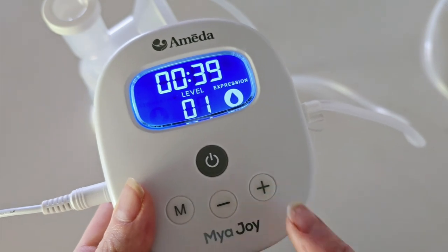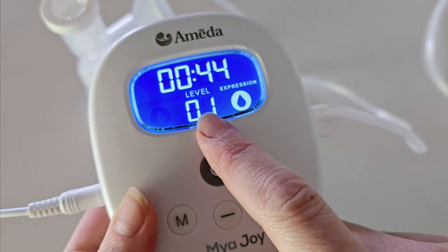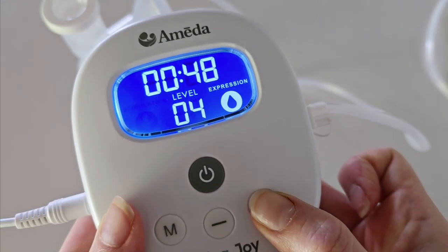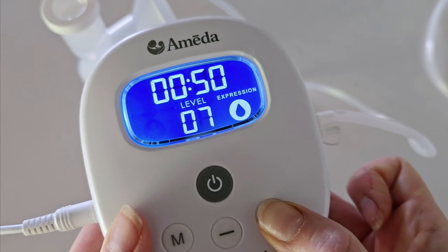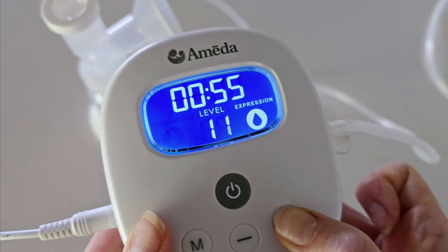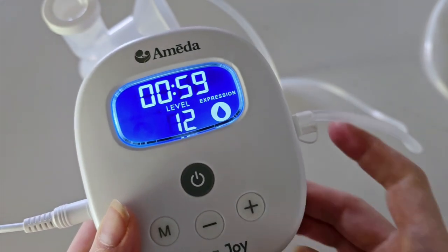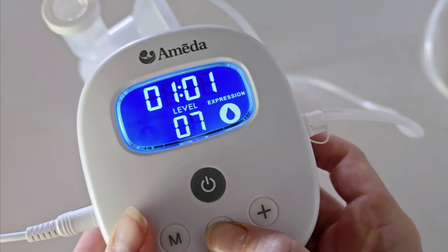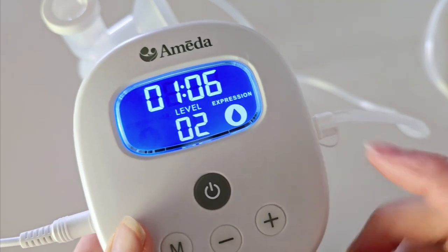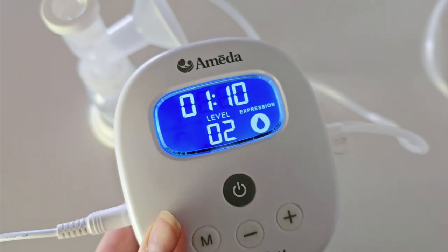The other control you have is vacuum strength. I always recommend starting on a lower level — a one or a two — and then slowly working your way up until you find a suction that is comfortable for you. You want something that's strong but comfortable. Adjust up and down with the minus or plus button. The display also shows a timer so you can easily track how long you have been pumping.